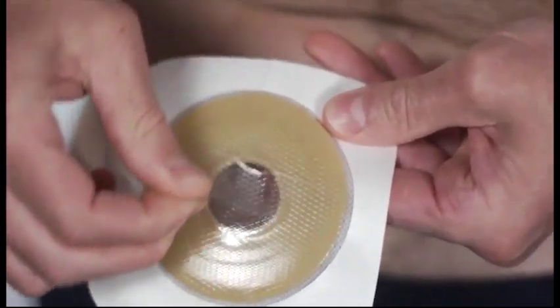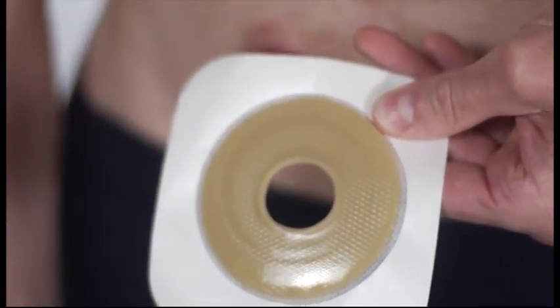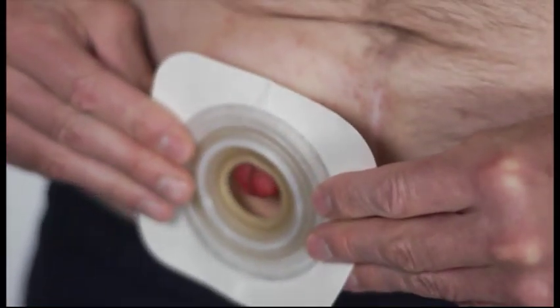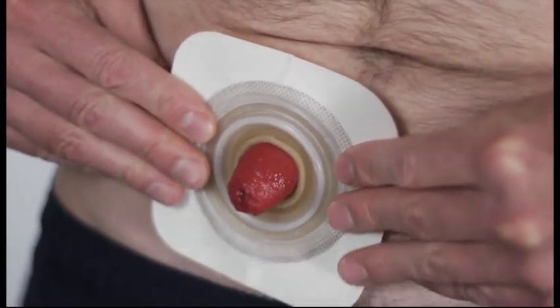To apply the wafer to your skin, remove the clear or opaque plastic release liner from the back of the wafer by pulling the blue tab or the edge of the release shield and immediately center the opening over your stoma.